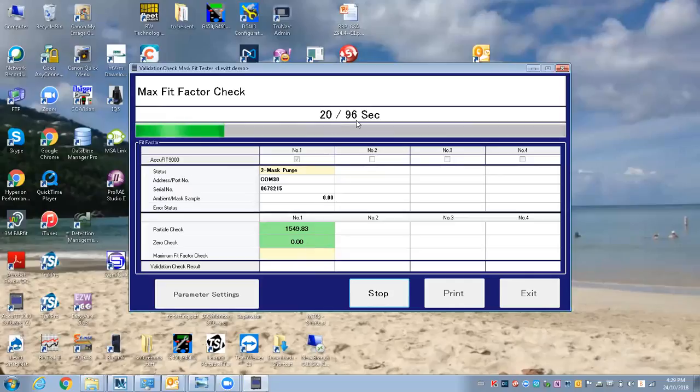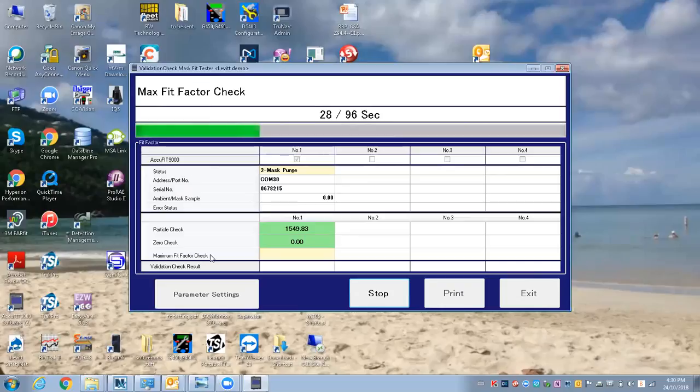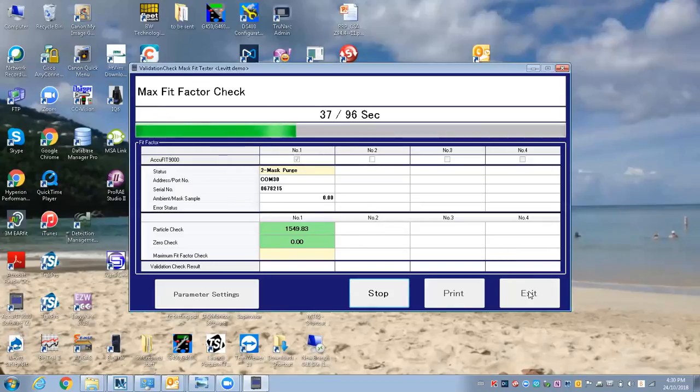This is actually going to take a while. This goes through, there should be no problem—it's just calculating the final maximum fit factor check value. I'm going to stop it, but it would come up and say successful and then you'd be able to start doing the fit test.